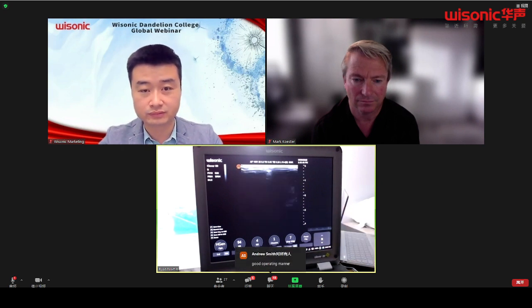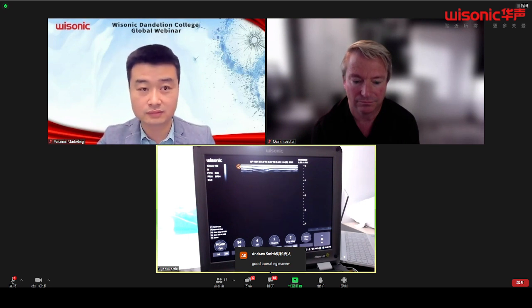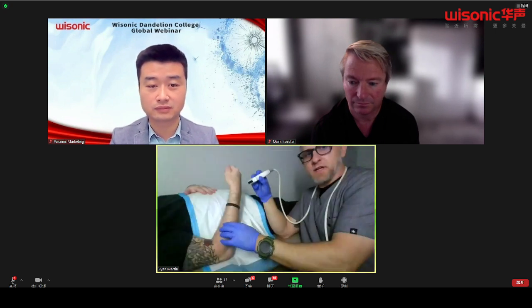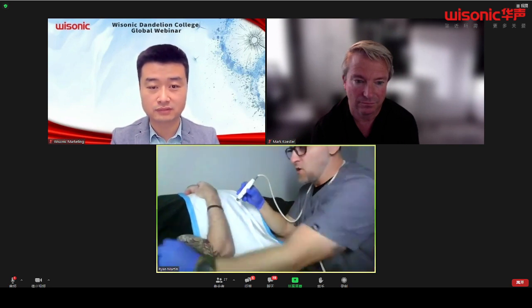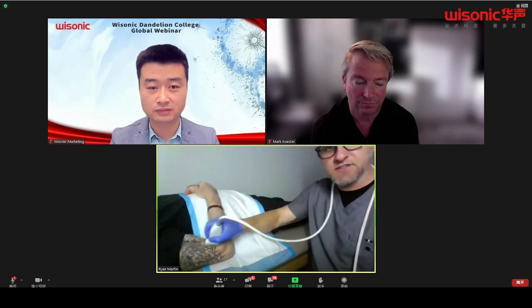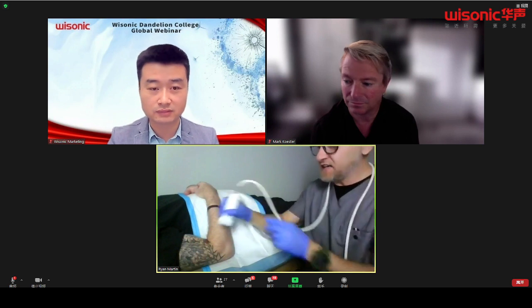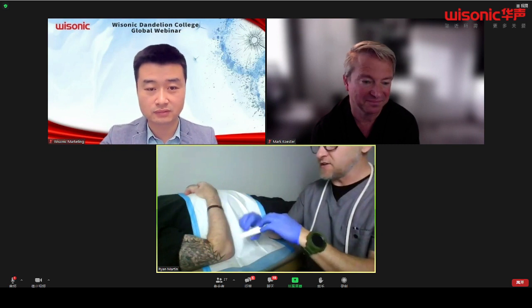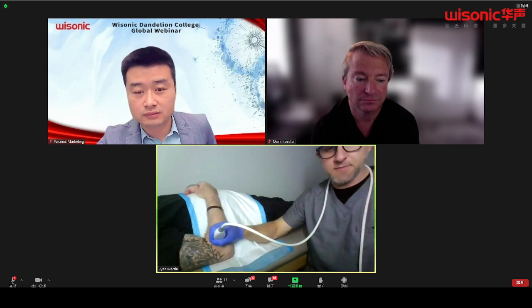Okay. Now, from here, I'm going to give you two different windows of the biceps. The anterior one, I'm going to skip for right now, but since I have him here, I'm going to have him put his arm in this cross position here in 90 degrees. Now, remembering what I said was follow the bicep, right? So follow the bicep down to the radius, and you'll have a much easier time finding that bicep window. So again, this one is going to be your lateral window. So again, I'm right here, following the bicep down.